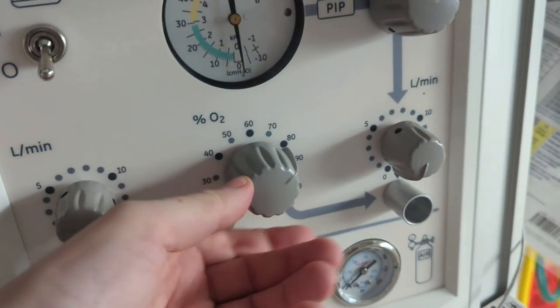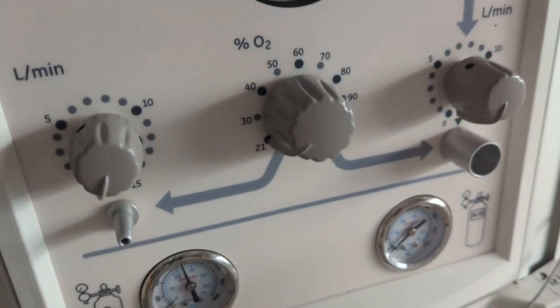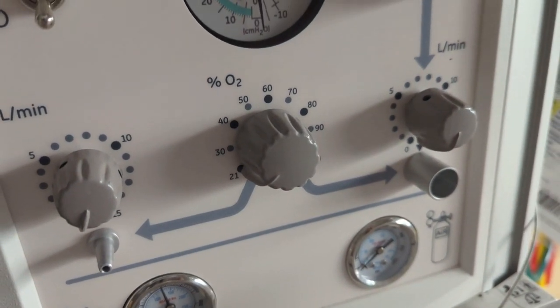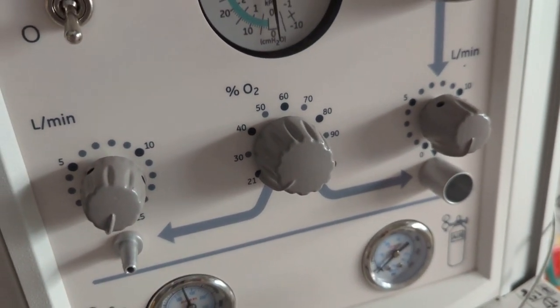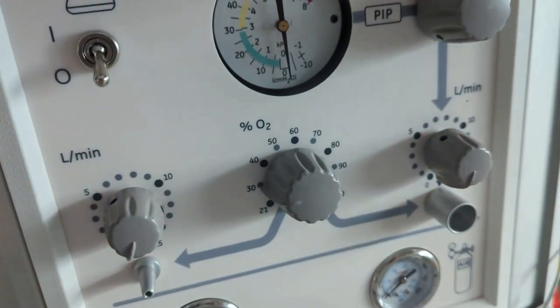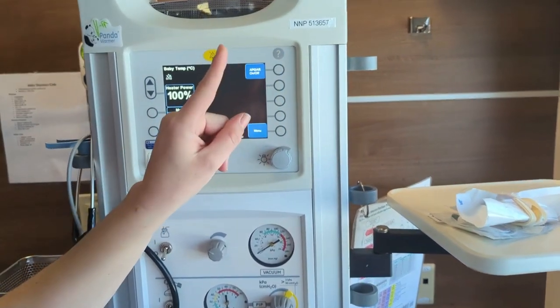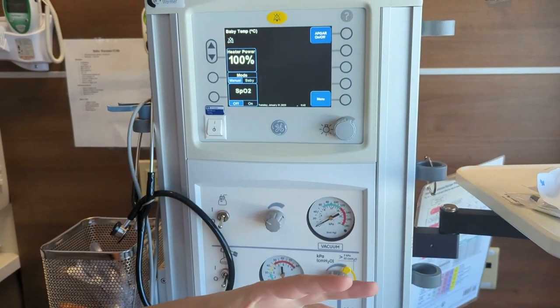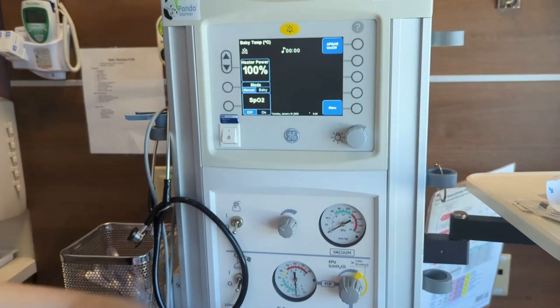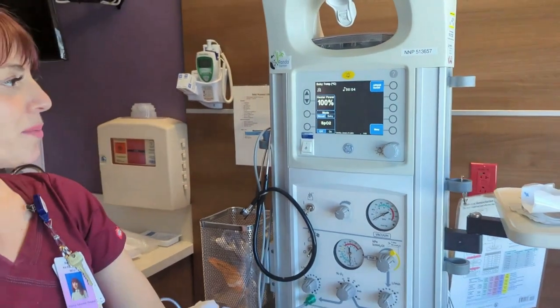This is our oxygen blender. For almost all of our term babies we're going to start off at 21%. For babies under 34 weeks, we can start off at 21 to 30%. When the baby is born, we're going to hit our APGAR timer when the entire body is born — not just the head — and this gives us a good count of how long our baby has been around.